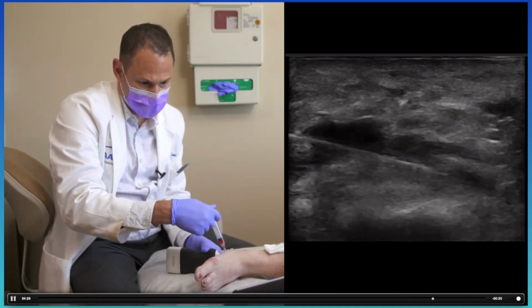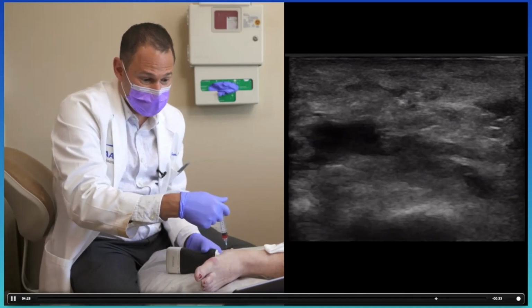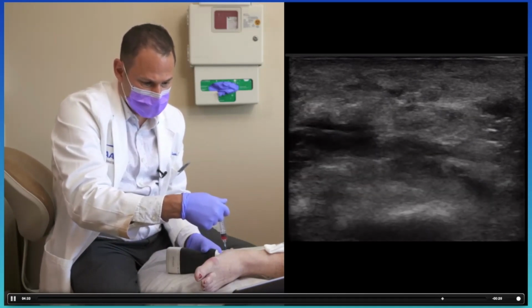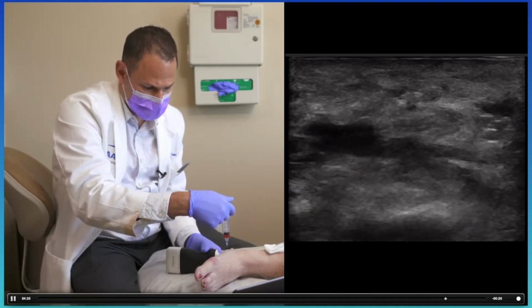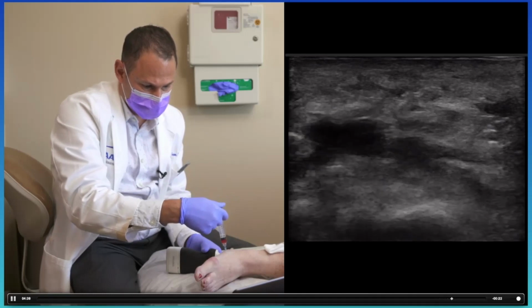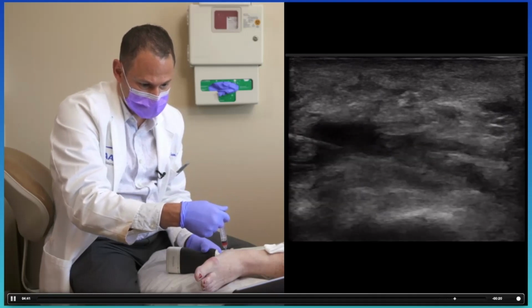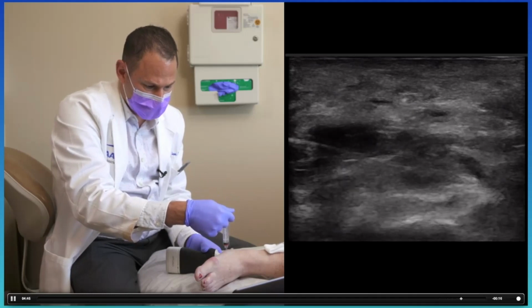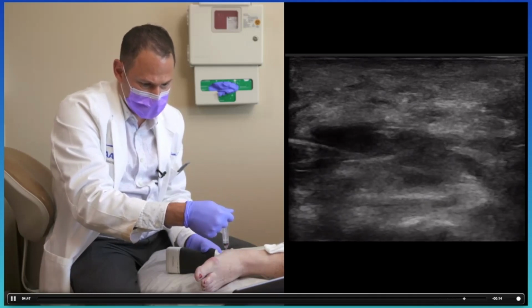So basically, this patient underwent a tibial nerve block prior to the PRP injection. The PRP was injected into the plantar fascia, which can be a painful shot. The tibial nerve block alleviated the pain of the injection. The PRP is now on the plantar fascia. It may take a few days to weeks to work, but will hopefully give her pain relief superior to that of steroids.